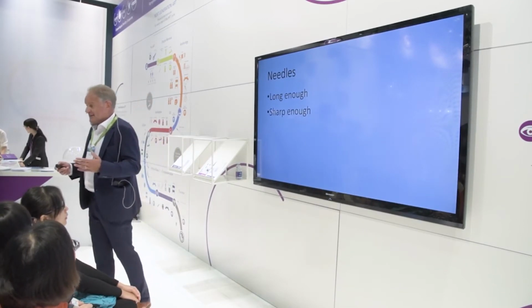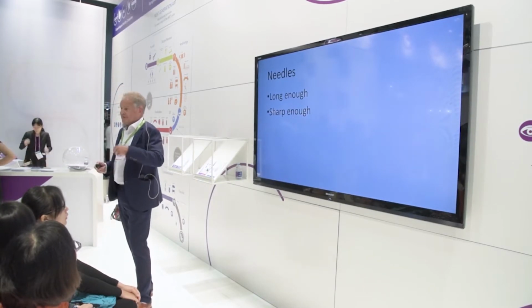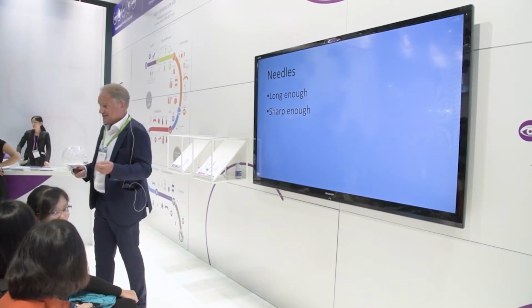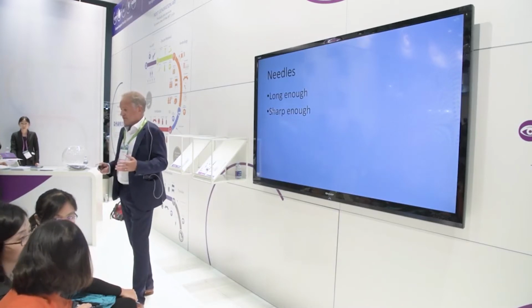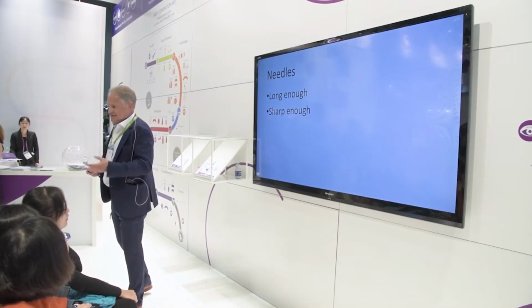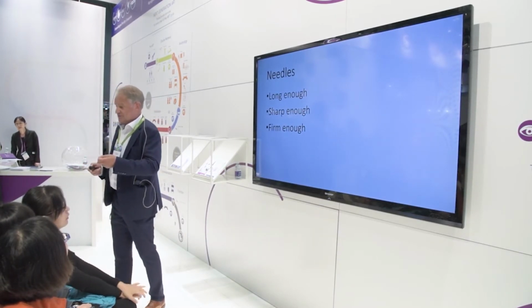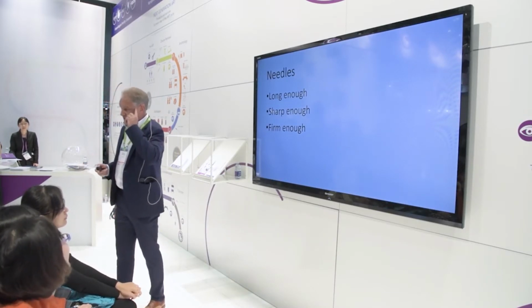But in the early days, in the mid to late 1980s, we used to have reusable needles, and many times the needle that we were given had been through an autoclave maybe 4 or 5 times and was quite blunt, and you had to put a lot of pressure in to pierce not only the vaginal mucosa but the ovary, causing significant trauma and maybe damage to the ovary. So it has to be exceedingly sharp. It has to be firm, because there's no point in thrusting the needle into the vaginal mucosa and it bends or distorts or doesn't even pierce the ovary.